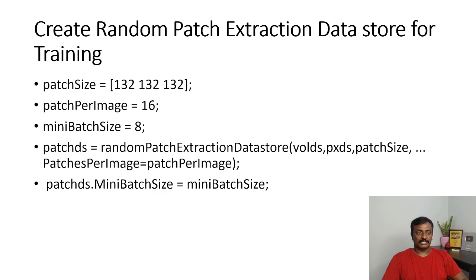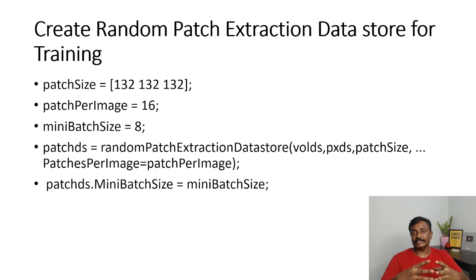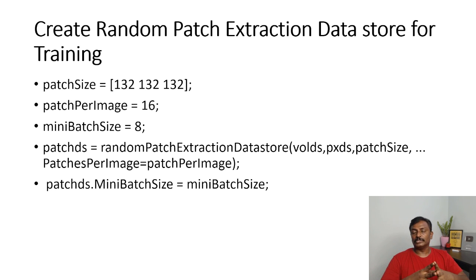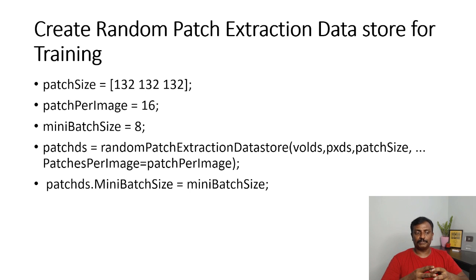The second step is to create a random patch extraction data store to create a data store for training. The patch size, the image size is 132 by 132 by 132. Patch per image is 16 and mini batch size is 8.